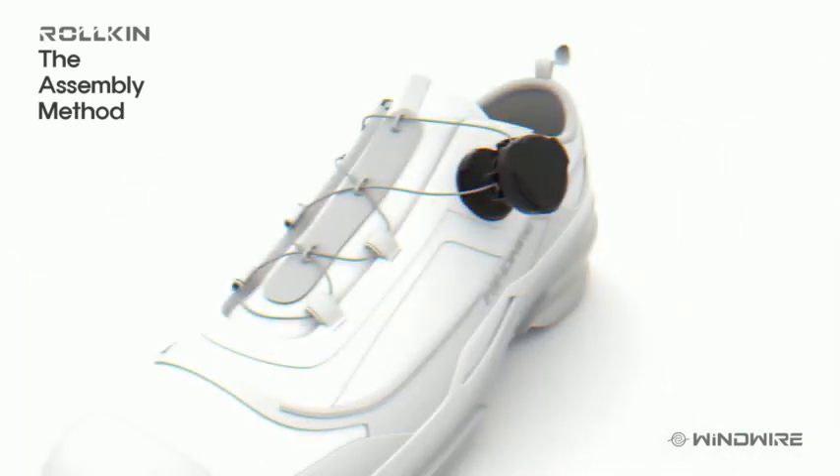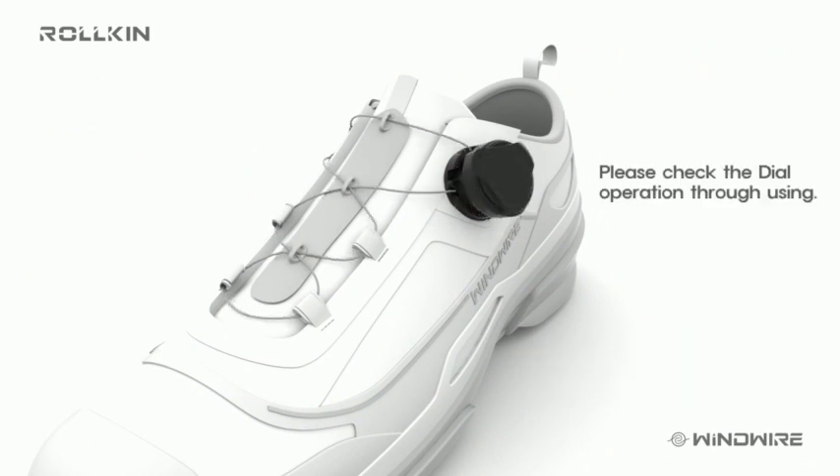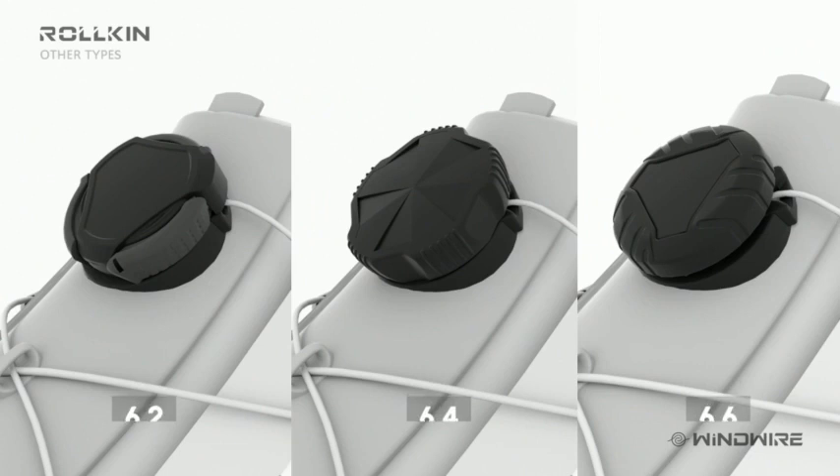Fully insert the back side of the cap set into the bottom hole first, then press the front side to complete the fastening. Please check the operation of the dial at least 3 times. If the assembling is incomplete, loosen and assemble again. Disassembly is the reverse of assembly for after service.